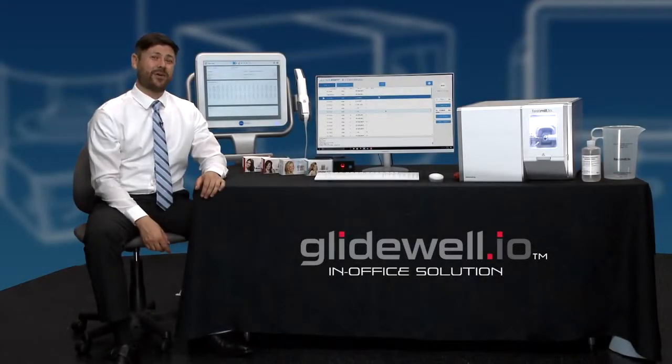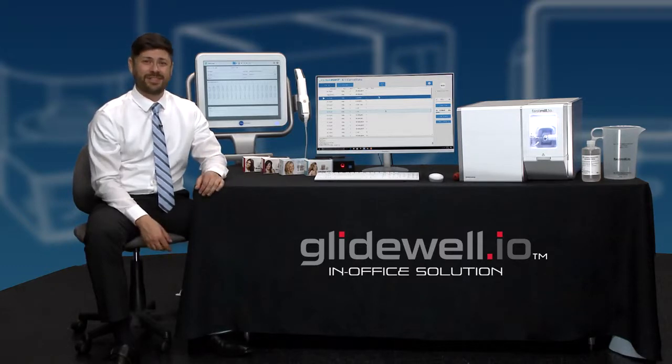The Glidewell.io in-office solution is an intuitive chairside milling system that elevates same-day dentistry with a simplified process. It's simply a matter of scan, design, and mill, drastically reducing the waiting time between preparation and restoration delivery for both the doctor and the patient. It also provides support via direct communication with Glidewell Laboratories and its team of highly experienced digital production specialists.